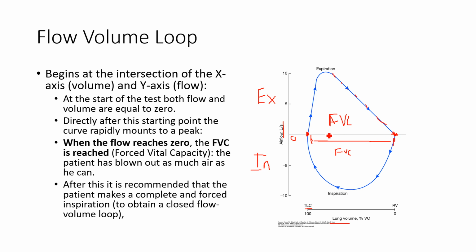While there is an inspiratory component, because we get them to total lung capacity, full lungs, the volume that we're assessing is moving from this point to this point. Again, it's this value, that's the FVC. And if we know what residual volume is, we can add this value to residual volume and get total lung capacity, TLC, not the band, the lung volume. So that's that maneuver.